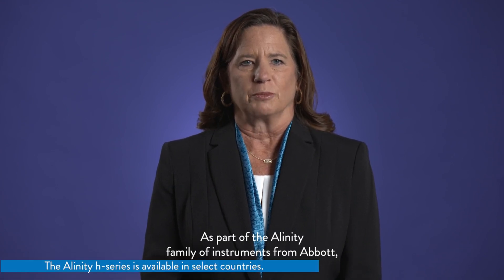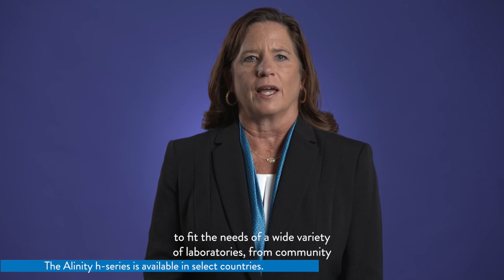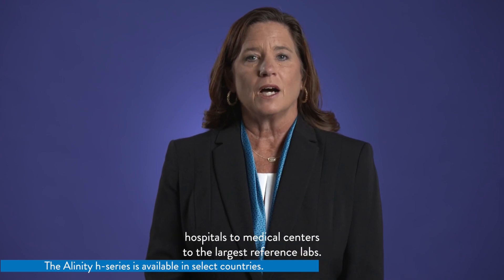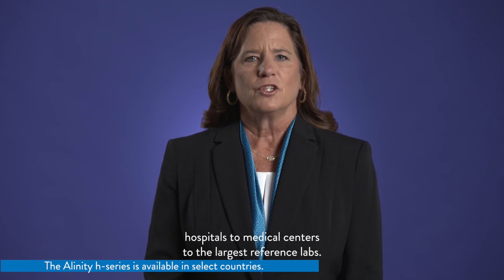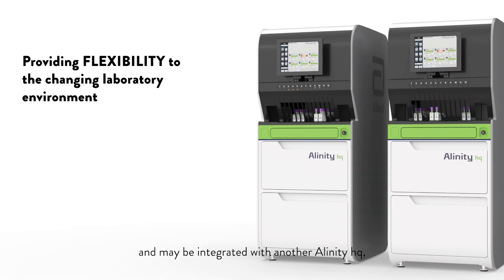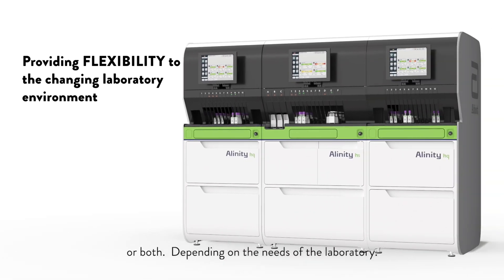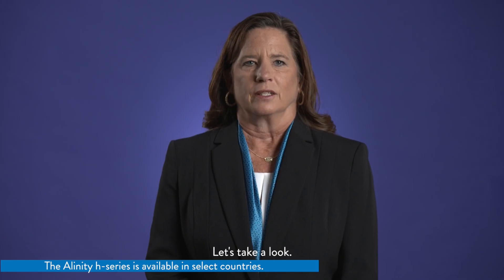As part of the Alinity family of instruments from Abbott, this multi-modular, fully automated hematology system is scalable to fit the needs of a wide variety of laboratories, from community hospitals to medical centers to the largest reference labs. The Alinity HQ is designed to be a standalone analyzer and may be integrated with another Alinity HQ and an Alinity HS, the slide maker stainer, or both, depending on the needs of the laboratory. Let's take a look.